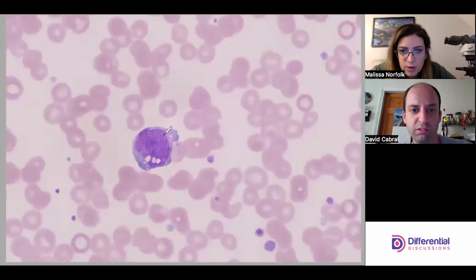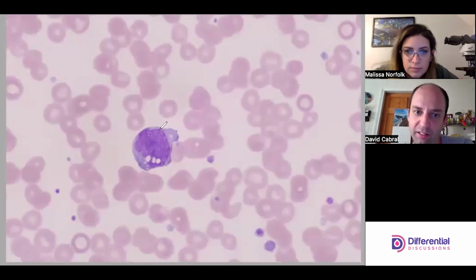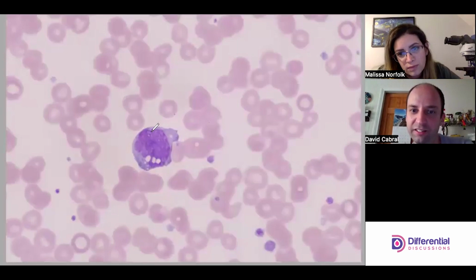There might be one here. Yeah. I think that's where my eye was going, or maybe right there. What about the first one that you pointed out? Go to the left of that. Like this? Yeah, I was looking at that. Yeah. It kind of just looks like a striation.